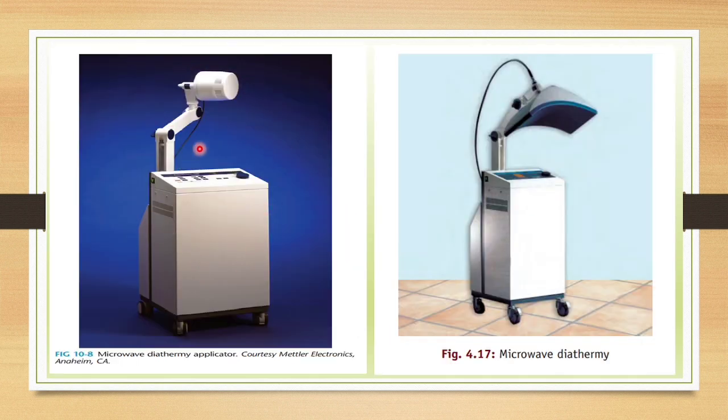These are the different applicators of your microwave diathermy, the circular emitter as well as the rectangular emitter. There are different brands, and most of the machines are costly.